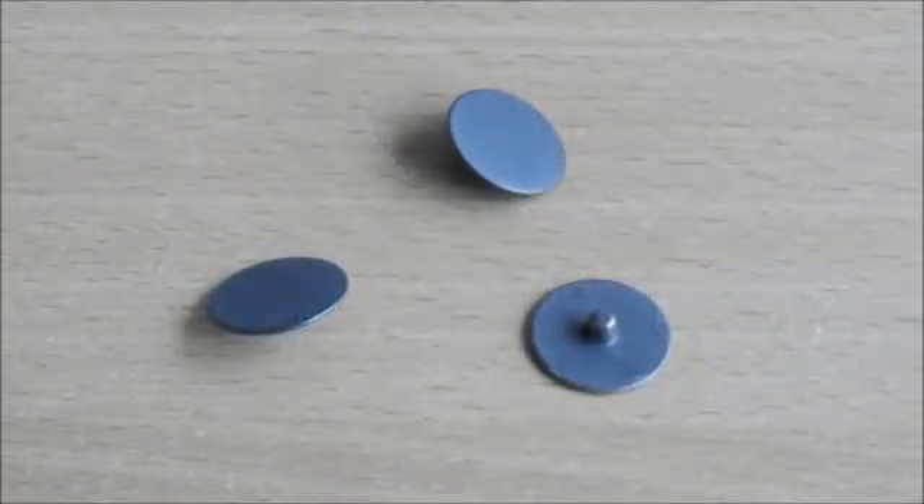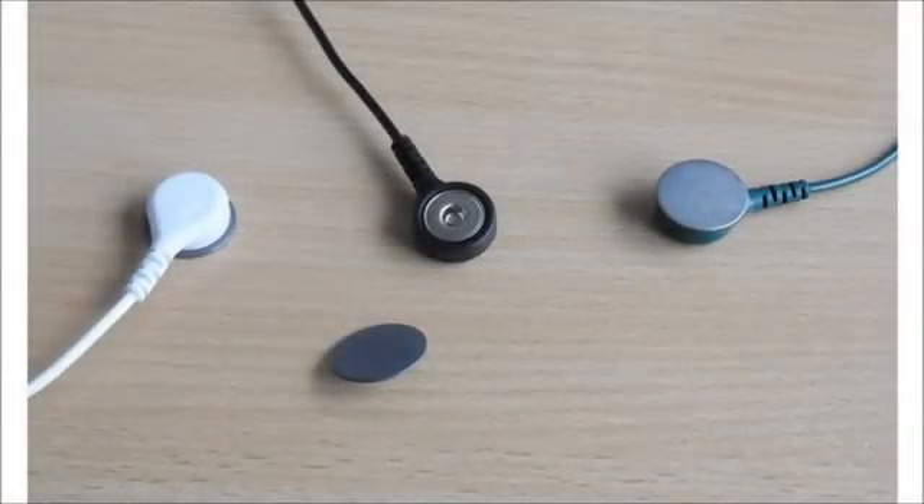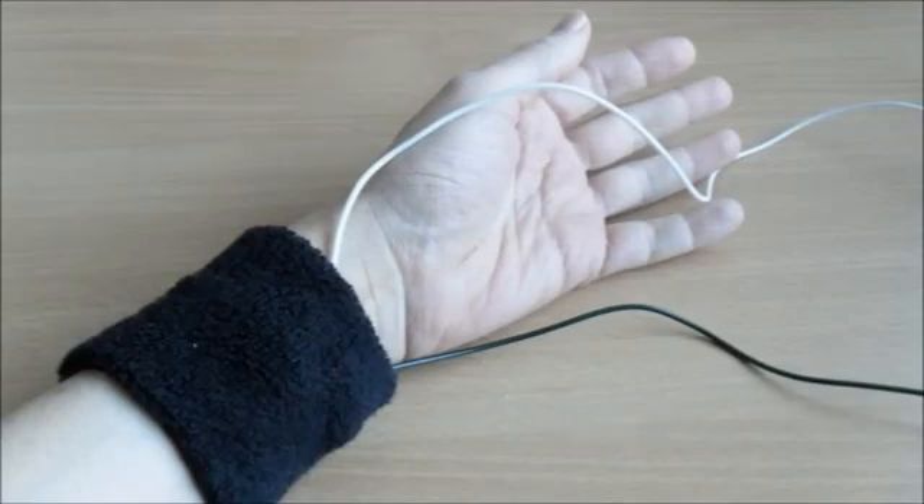We can even get a fairly good signal without using pre-gelled snaps. A very viable alternative is to use these non-gelled reusable snaps. They snap into the cable heads just as before. They aren't self-adhesive but you can hold them against the skin using wristbands — just make sure the ground doesn't touch the active. It's definitely not as accurate this way, but for most people it's good enough for biofeedback where you're less interested in precise measurements and more interested in relative changes in muscle tension. I suggest using pre-gelled self-adhesive snaps for your first few sessions, then switching to this approach once you've got a feel for EMG biofeedback.